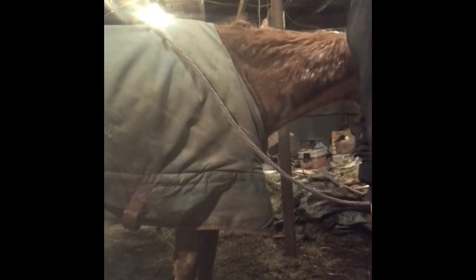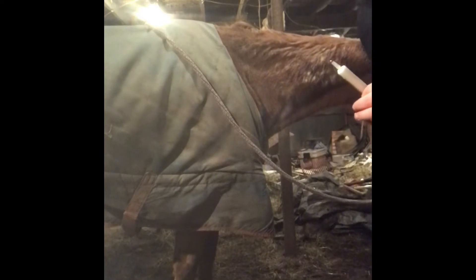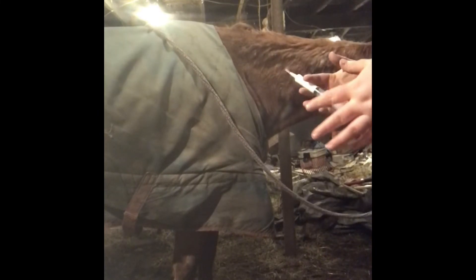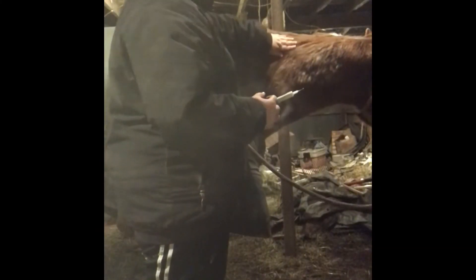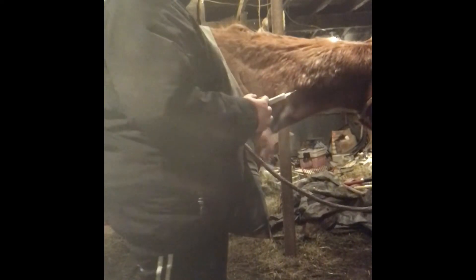You want to have someone hold your horse, but I don't have anyone to hold mine and she's pretty easy going, so I just have her eating a bucket of grain. Now, right here — you're going to have a hand's-width away from the mane and a hand's-width away from the jugular. This little triangle right here is what you want for the injection site.